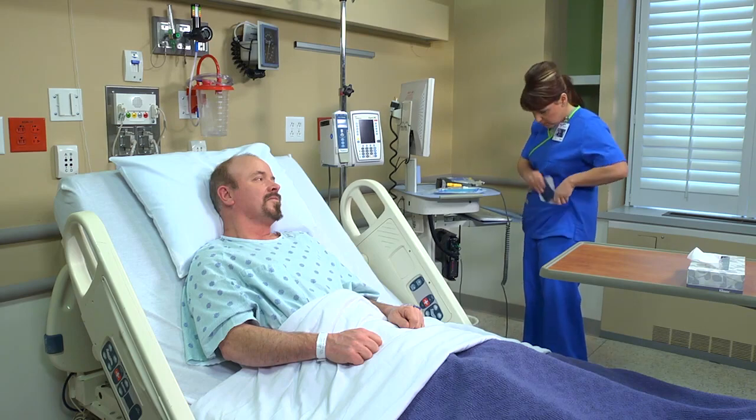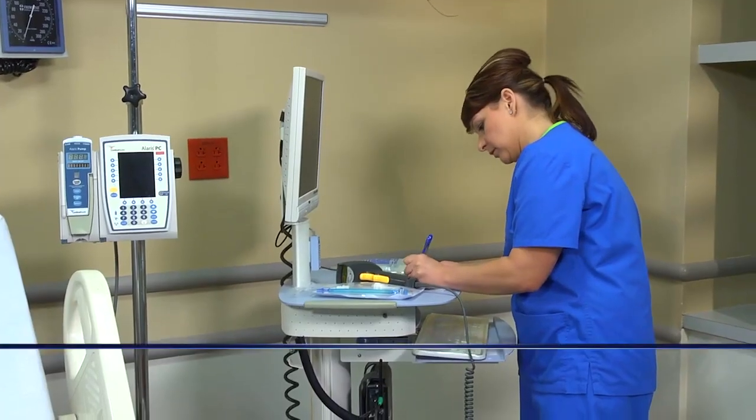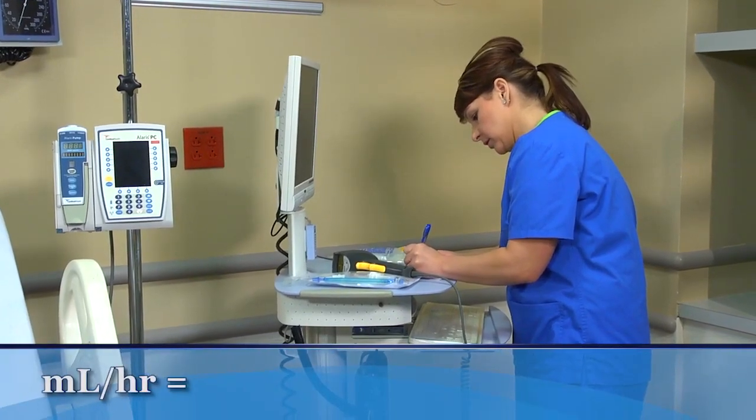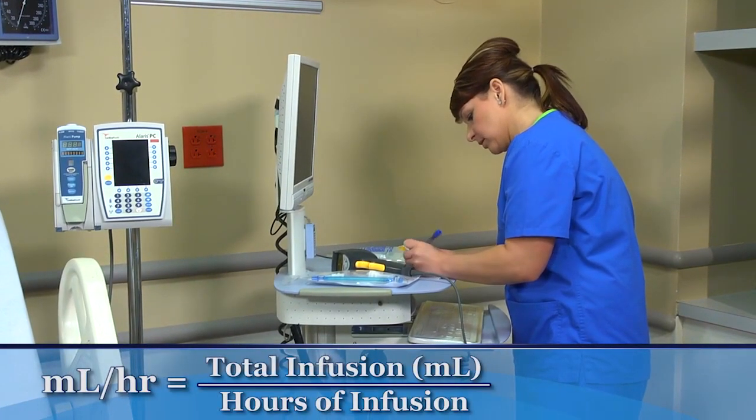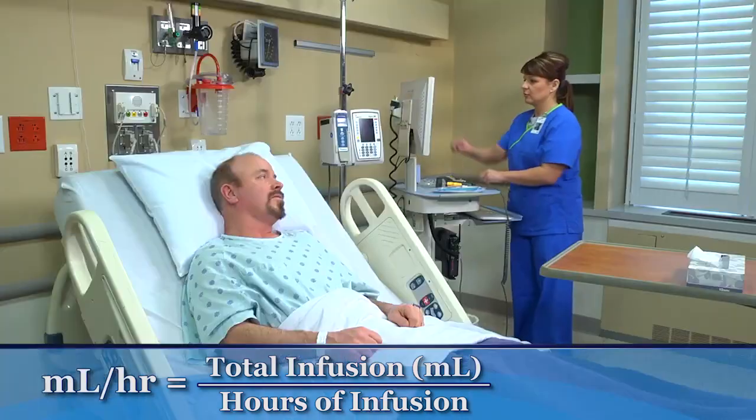Some electronic medical record or EMR systems calculate the flow rate for you. To manually check the hourly volume in milliliters, divide the total volume of the infusion by the total number of hours over which the fluids will be delivered.